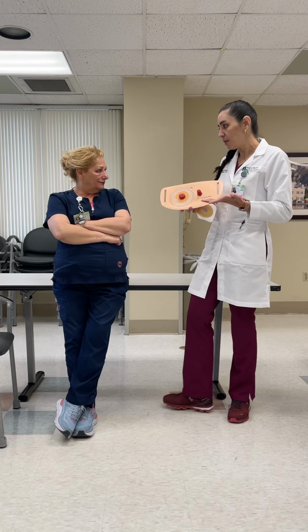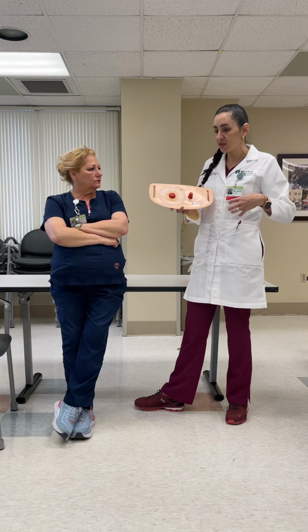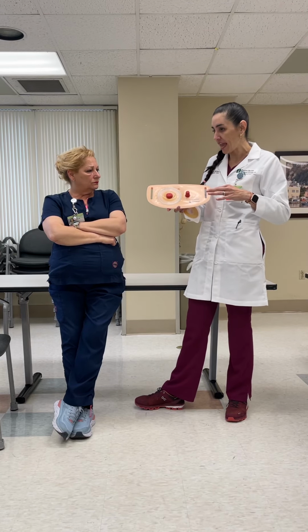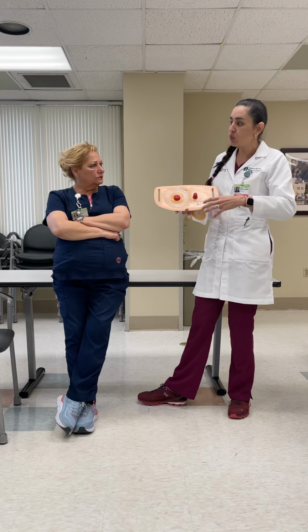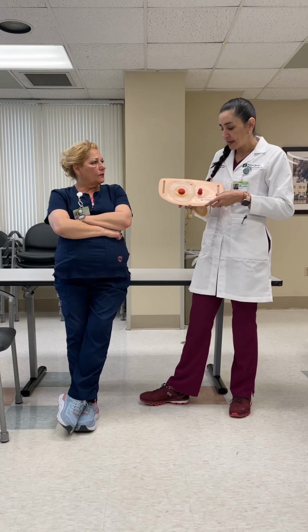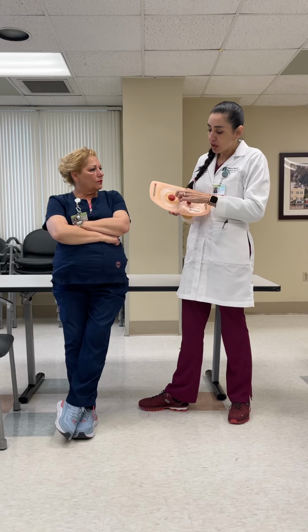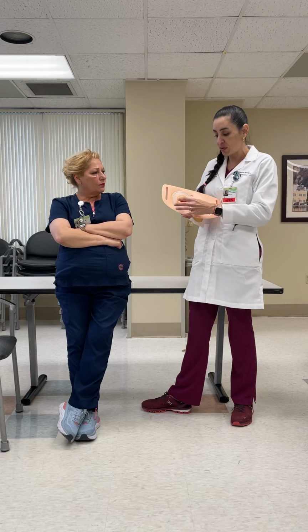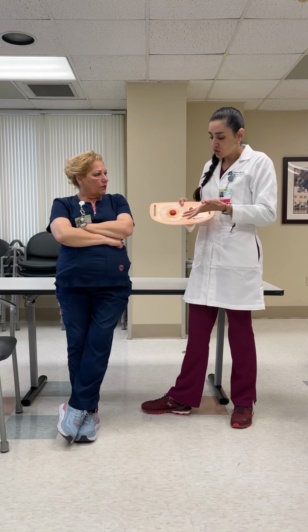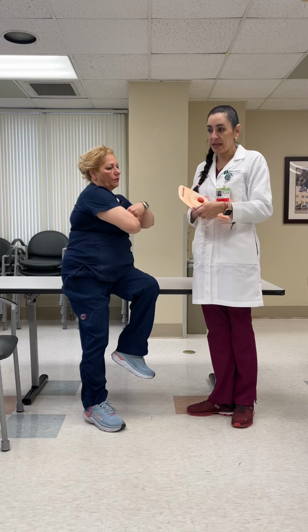So those are important findings, because especially if the supplies are going to be cut to fit, we need to explain to the patient that they have to reassess the stoma size after these 8 weeks. Or if it's pre-cut, we cannot pre-cut it right away after surgery. We have to wait until the stoma has its usual size, because if you cut the stoma opening too big, you're gonna have problems with your skin, you have high risk for leaking, and those are complications that can happen, and that's why it's so important to measure the stoma size.